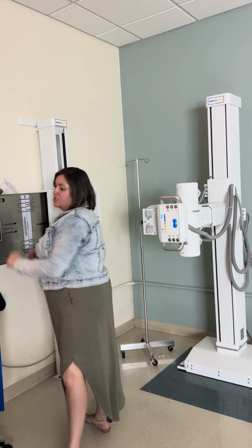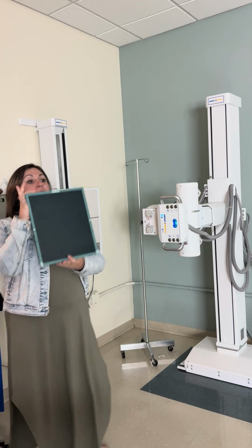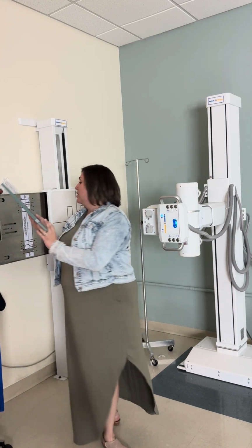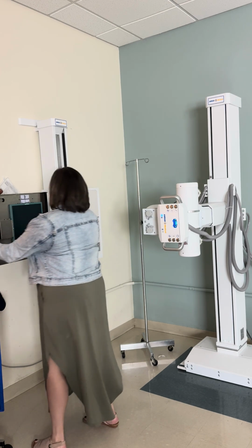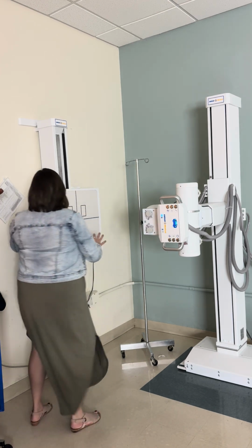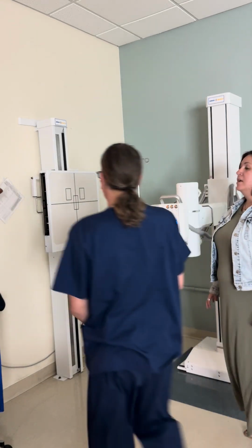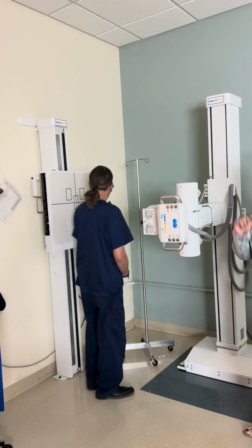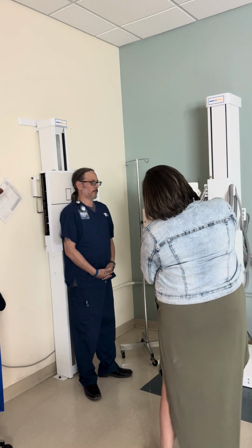So we are going to use a 10 by 12 image receptor for the 3 views of the C-spine lengthwise, okay? So it's going to go in here 12 top to bottom. And then I'll have my victim come and put his back against the board here. So for the AP C-spine, we're going to use a 15 to 20 degree cephalad angle. So we're gonna go with 15.